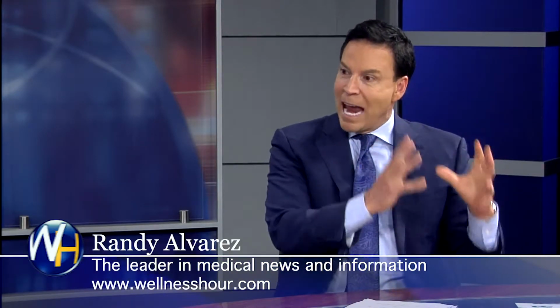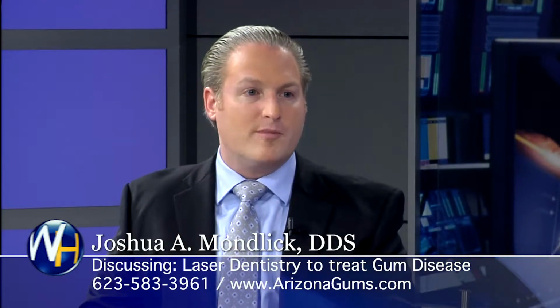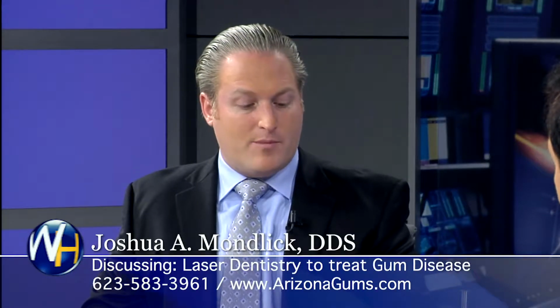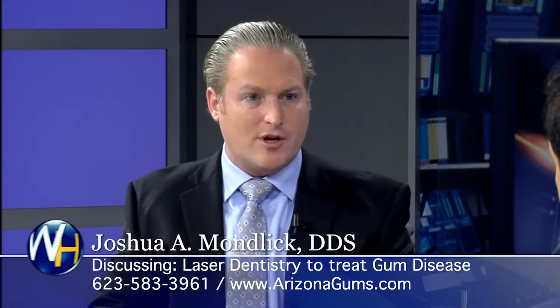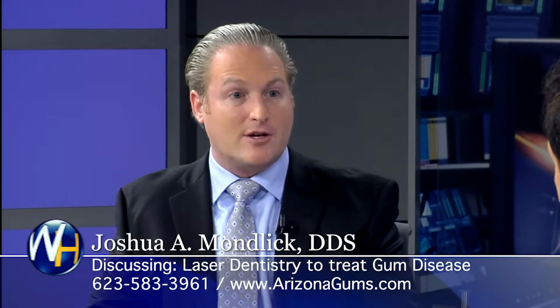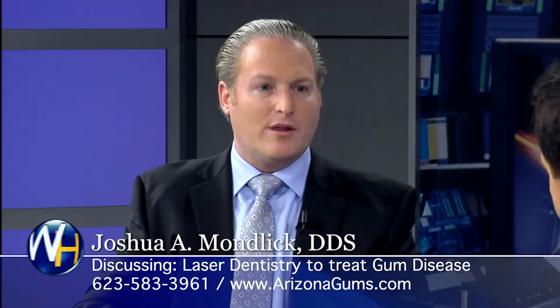You can just get rid of it with laser light energy. So once you go around with the laser, you can actually show an after slide. Yes, and those bugs are dead. There's no more movement. The bugs are dead, and everything is still, and that's what you want. We're also seeing a difference in the bacteria between the types of treatment. With the traditional approach, the bugs will disappear for a period of time, but studies have now shown that often the bacteria will come back again, whereas we're seeing that not happening as quickly with the laser.